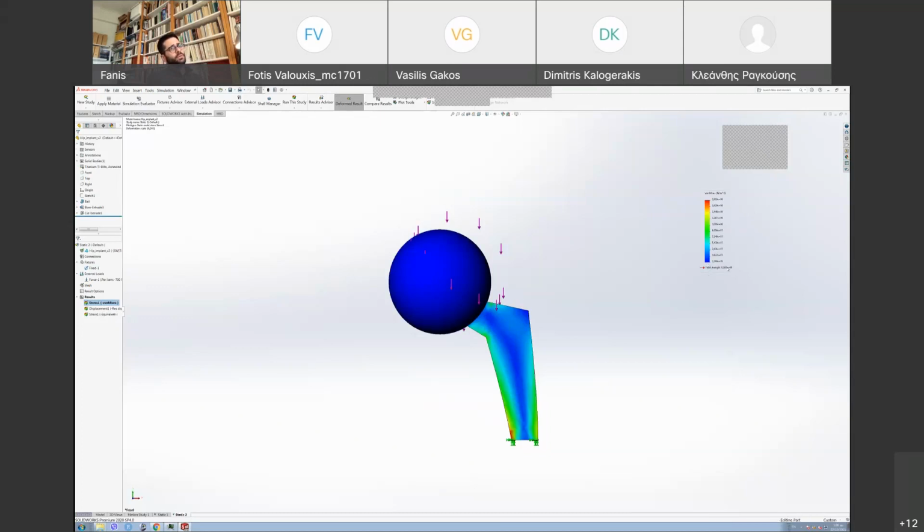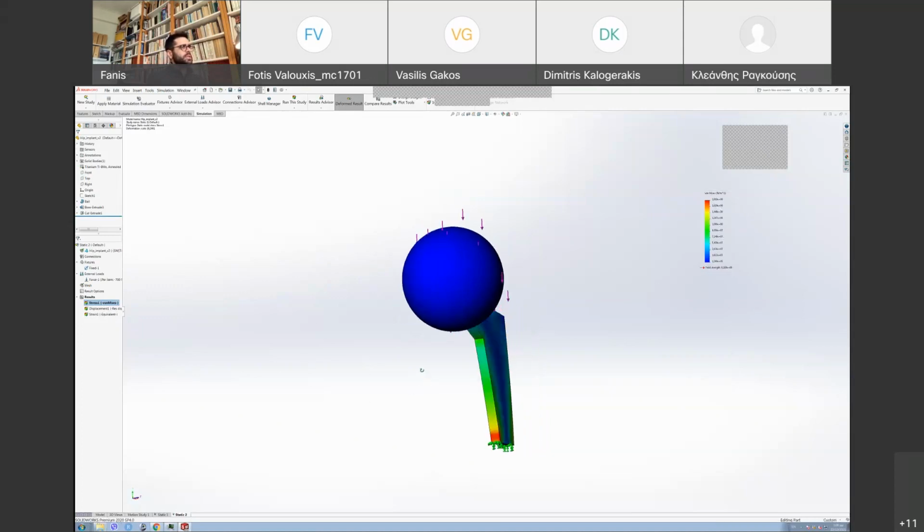Also, in case you overcome the yield strength, you see here there's an arrow, it will appear here. You can change the scale here and stuff like that. And you can see with the color diagrams what are the most critical areas. For example, here is this for this design.